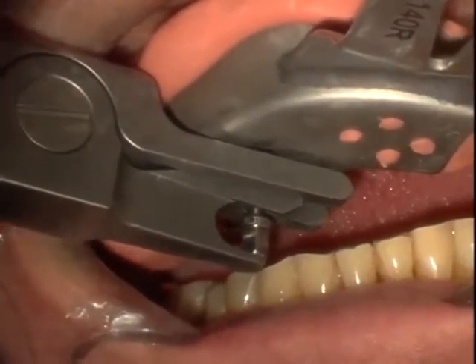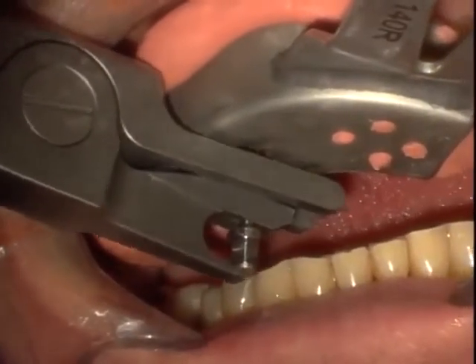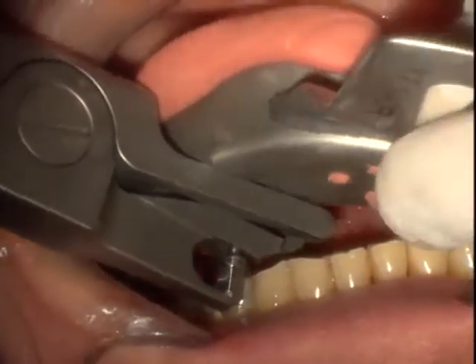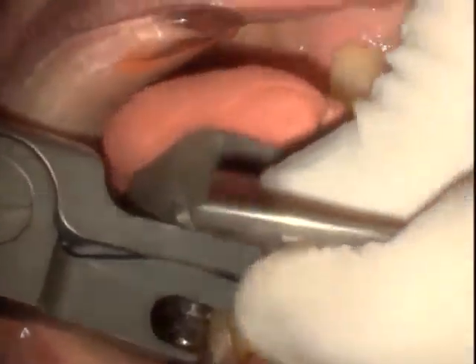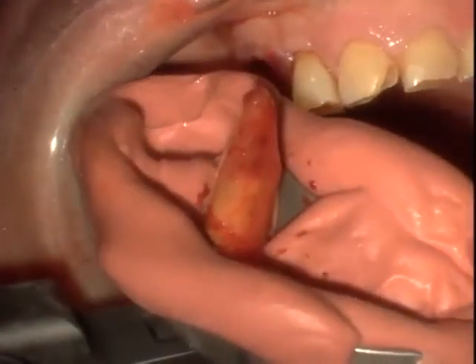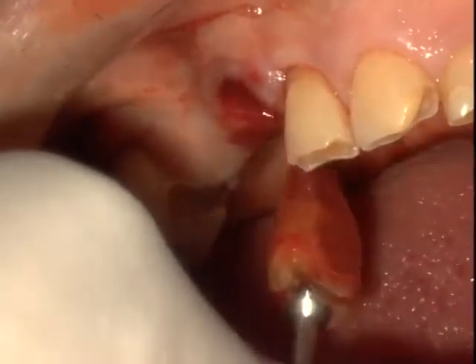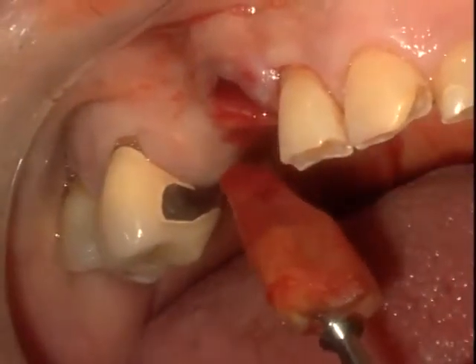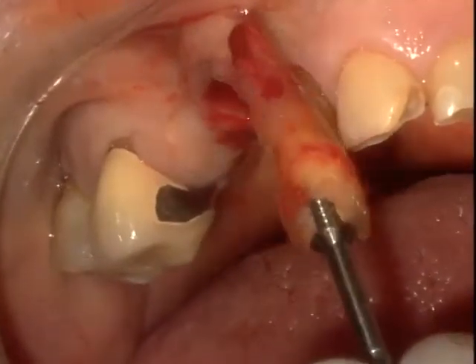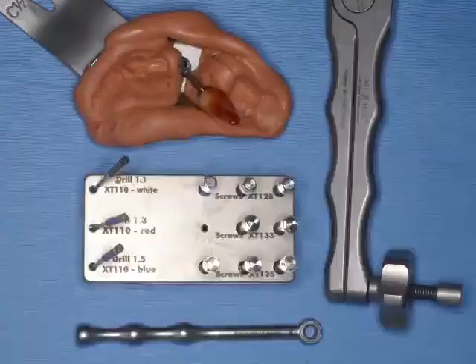We slowly now will advance this device. As we turn it, you can see the increase in the force being applied vertically, supported by the putty on the adjacent teeth, and eventually feeling the release of the tooth through the stretching of the periodontal ligament. Here, an extraction of a canine root completely atraumatically with no horizontal forces and no damage to the surrounding alveolar housing. A real atraumatic extraction technique, completely done without any trauma.